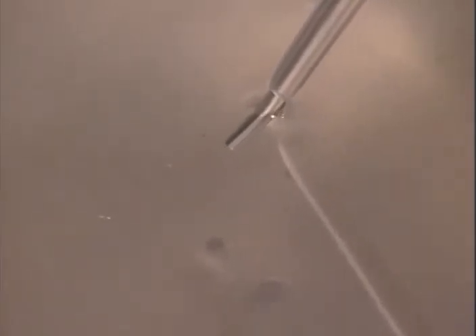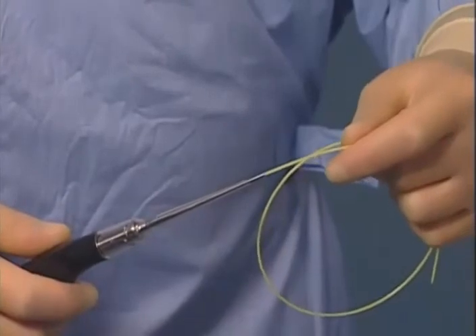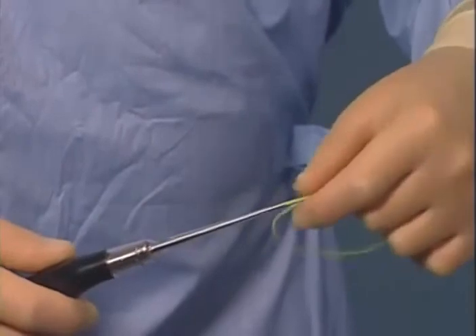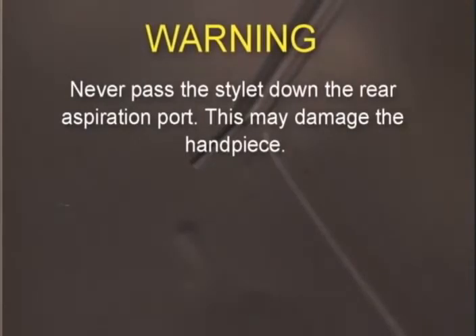It is advisable at intervals during the operative use to immerse the tip for a moment in sterile saline. This flushes the handpiece and prevents debris from drying on the inner surfaces, and so minimizes the risk of blockage. Should a block occur in the handpiece, the stylet should be passed up the central aspiration channel until the blockage is cleared. Then place the tip in sterile saline as before. Never pass the stylet down the rear aspiration port. This may damage the handpiece.